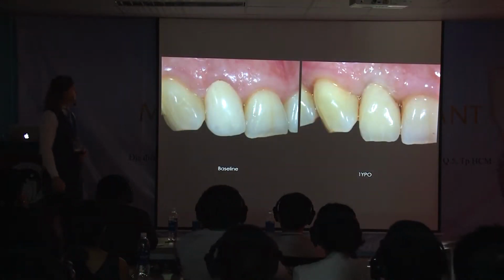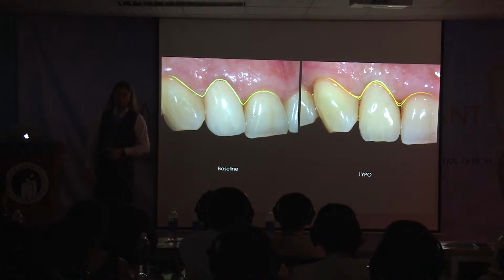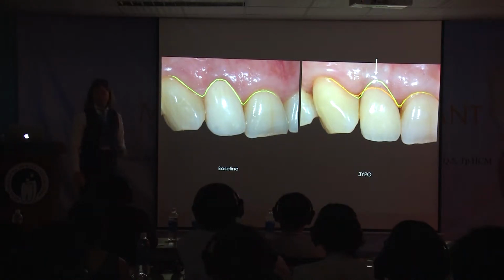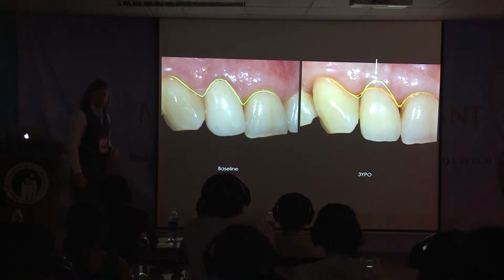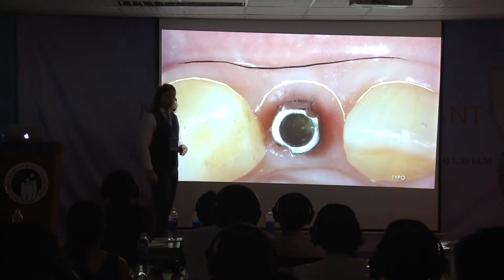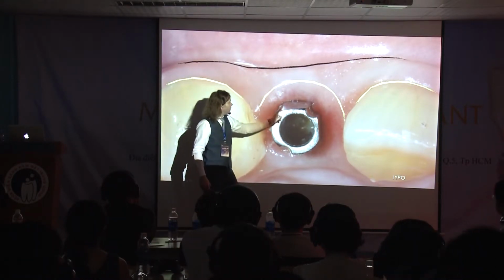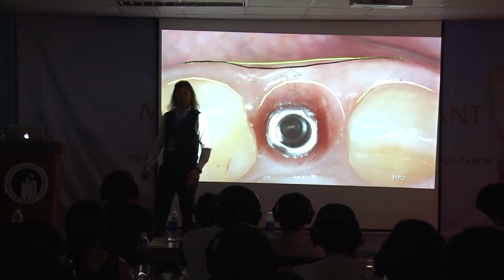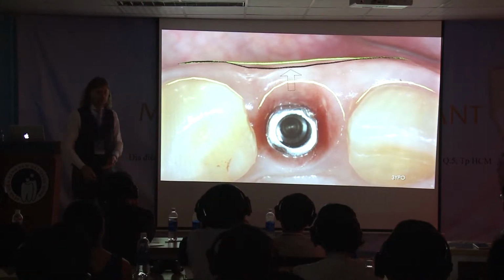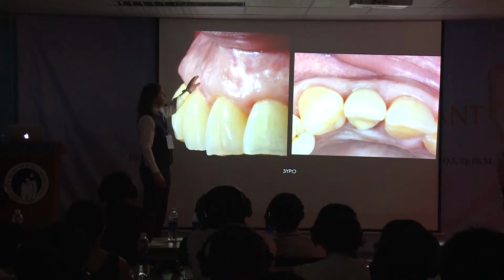This is at 1 year. If you make a comparison, tissue seems very stable. But look what happens over time. After 3 years, it grows. Why? The emergence profile and the thickness of tissue, before it was concave, and after it becomes convex. It grows alone, guided by the prosthesis. And you can see a nice root which is coming alone.